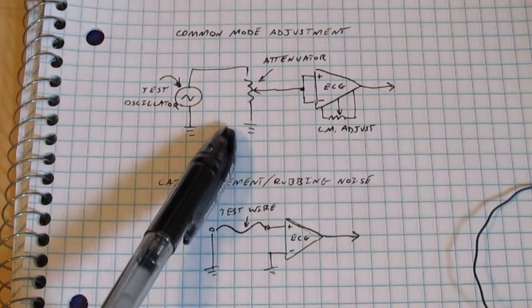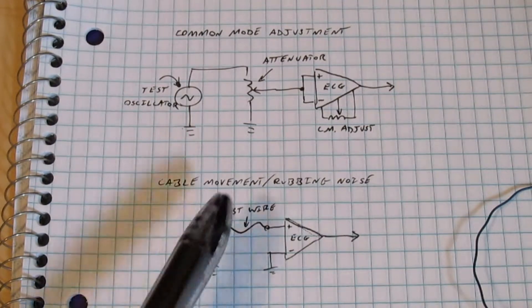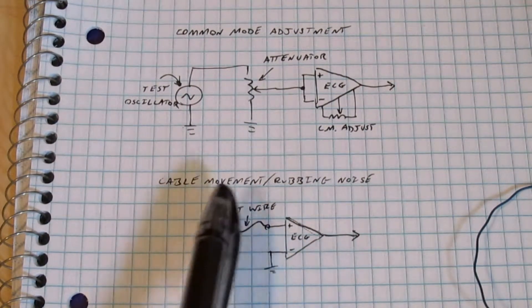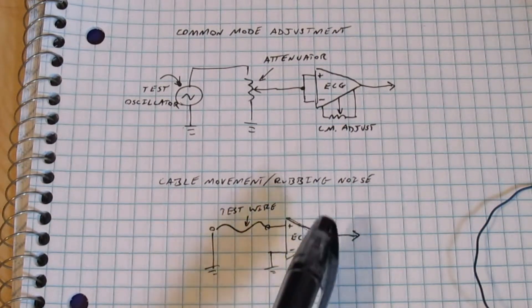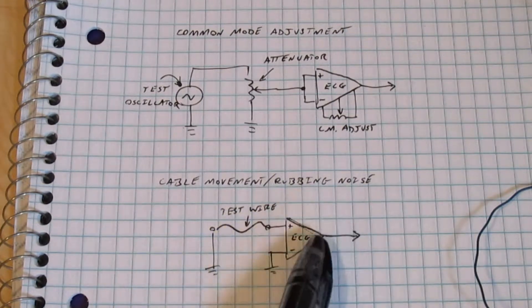Last time I got my common mode problem solved, maybe, and in this video I'm going to look at the cable movement or the cable rubbing noise source. The test setup for this one is pretty simple — I'll just have a piece of test wire hooked up to one of the inputs of the ECG, then I'll rub the insulation on it and see what kind of noise comes out.